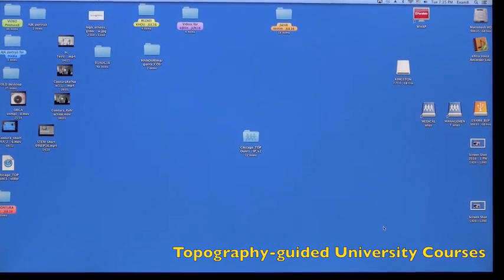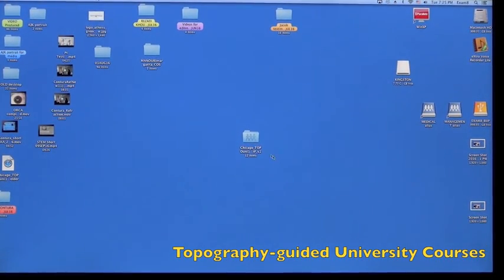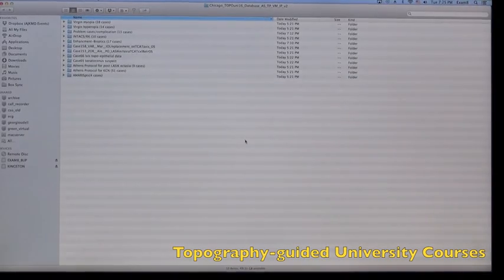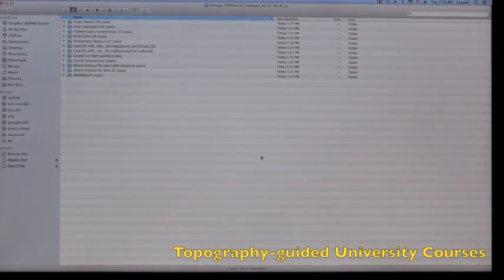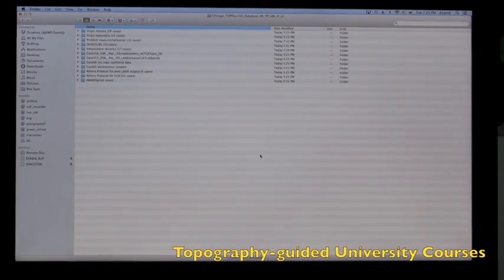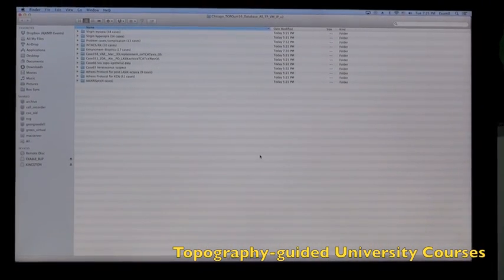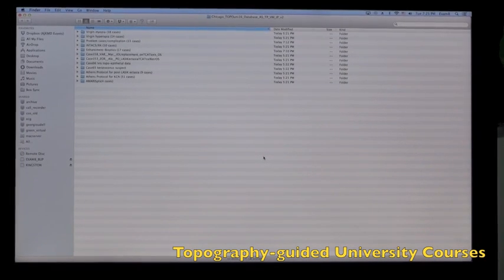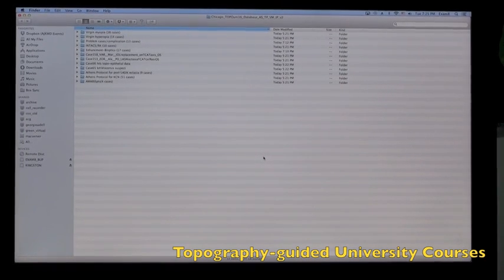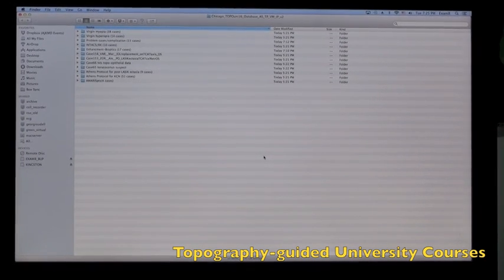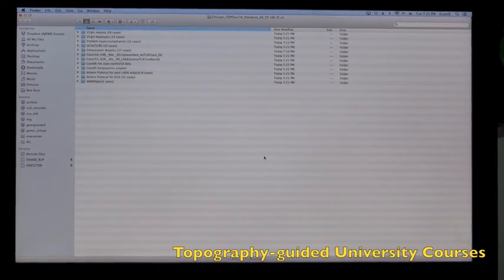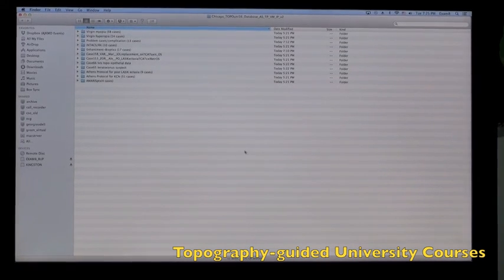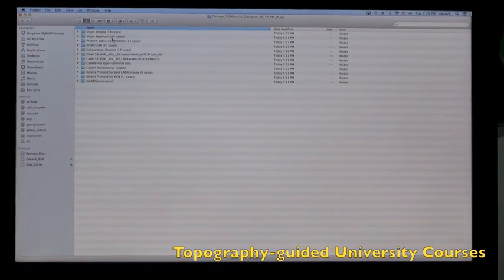Let's go ahead and click on this file. This file will be shared with you in a Dropbox fashion and we've grouped here the cases. This is over 150 cases. As you can see on the top, let's check one of the top folders: virgin myopia, virgin hyperopia.